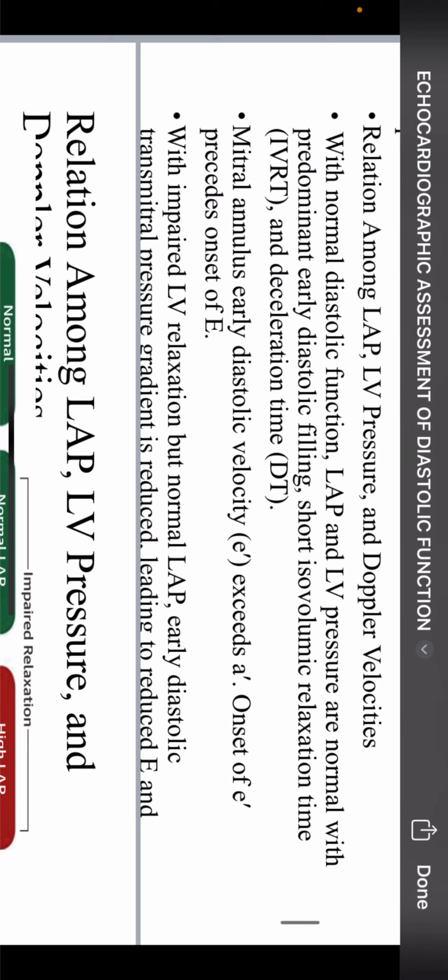So the first one is the normal diastolic function. The next one is just what I explained a few minutes back, when E wave becomes shorter than A wave. And now they have drawn some dotted lines in white on E, showing from the tip towards the end of the E wave. And that one will be called the deceleration time.